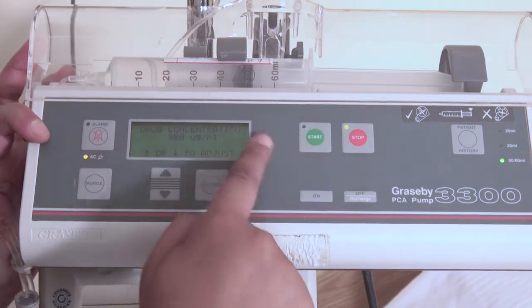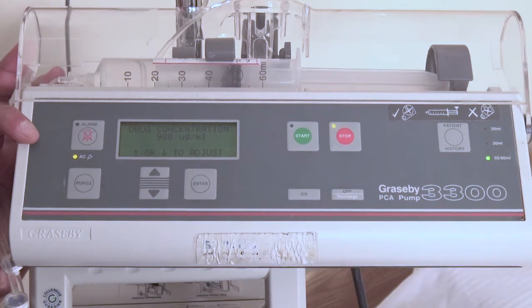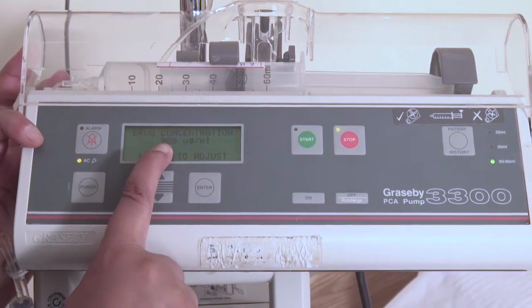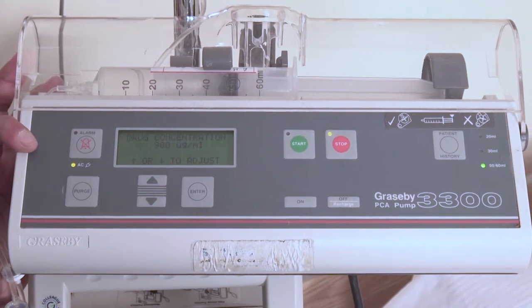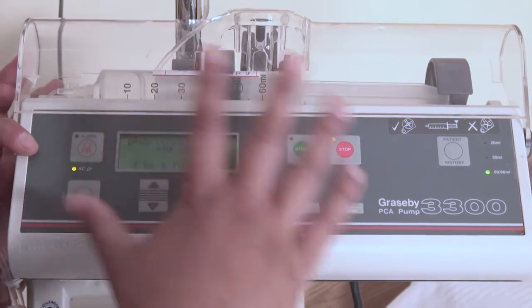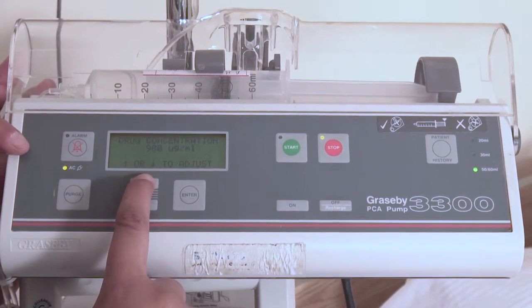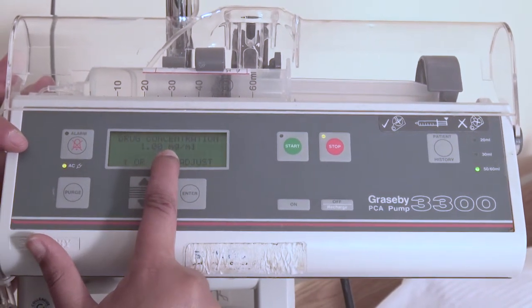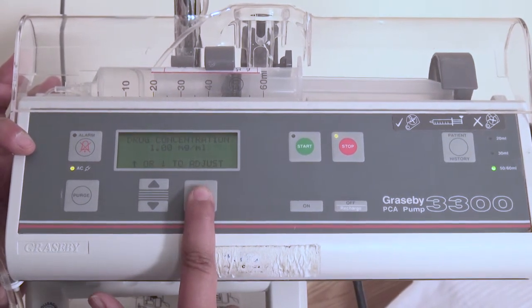On here it has a number of different settings that you need to set based on your drug orders and your MAR. The first one is drug concentration. You'll see it says 980 UG per milliliter. That's micrograms. Ours is morphine. And the concentration, if you'll remember on the monograph, said that after this was diluted, it's a 1 milligram per milliliter concentration. So I need to go up until I get 1.00 milligrams per milliliter. That is the drug concentration of my syringe. Then I'm going to press OK.